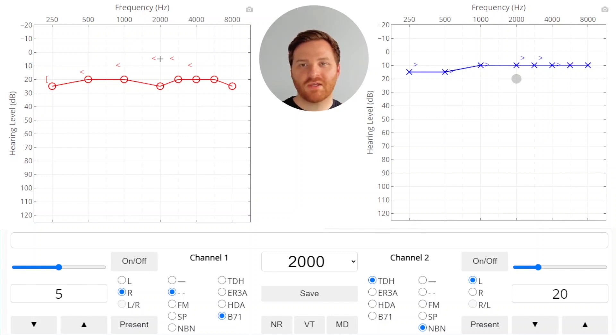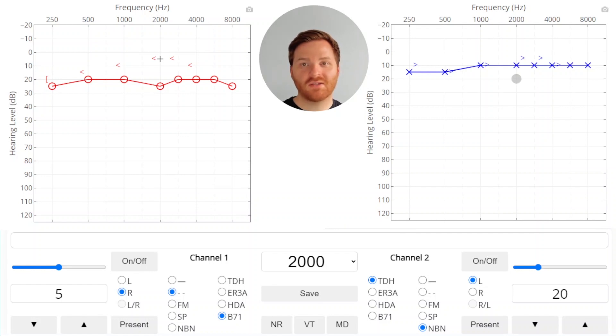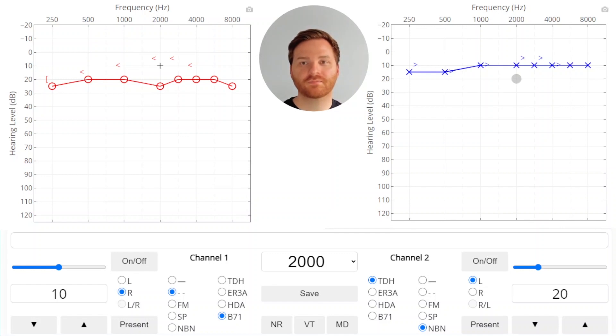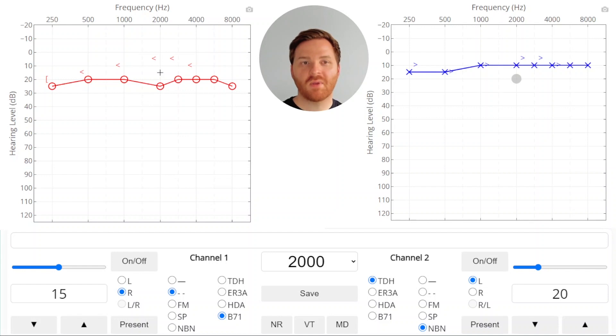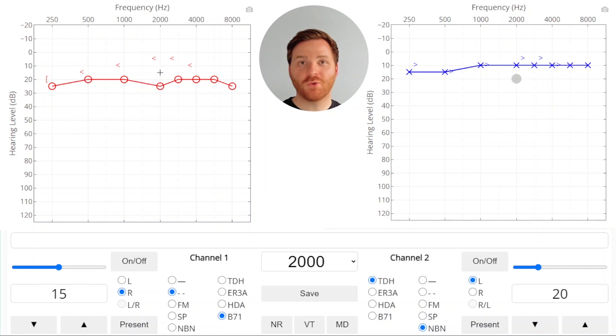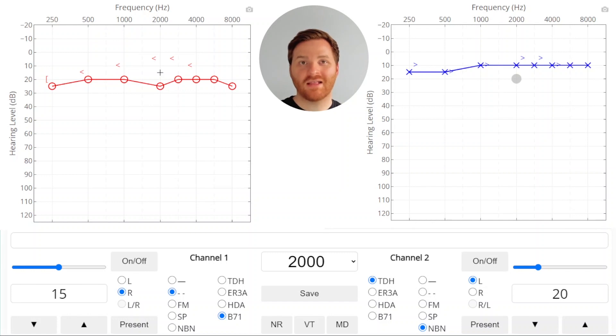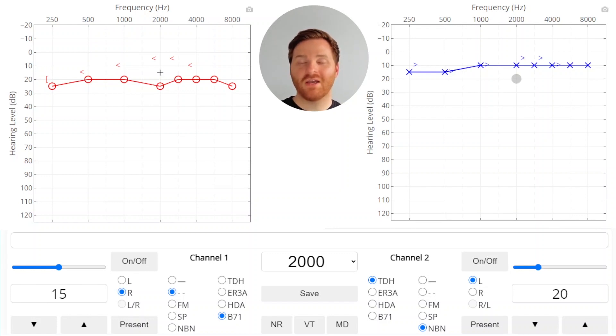So we'll present our stimulus, and we're effectively masking, so we're going to raise our stimulus to get closer to the true threshold. No response, and we got a response. So the patient heard the response, but at this point we don't know if they heard the response because we're at the true threshold, or if they responded because we turned the signal up loud enough that they're able to hear the new crossover signal that's a little bit louder. So we're going to increase the masker to try and cover up the non-test ear to make sure that our response is legitimate.